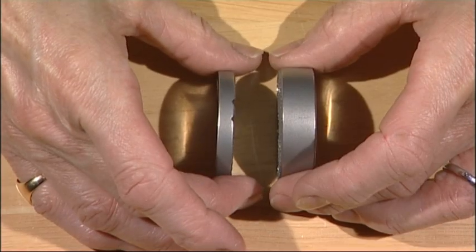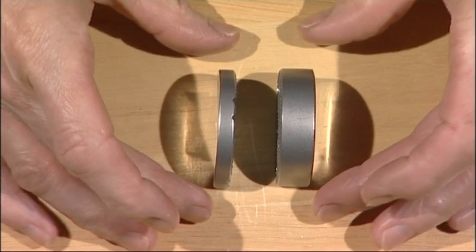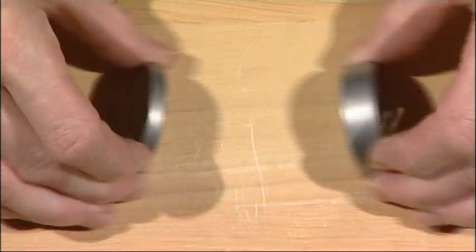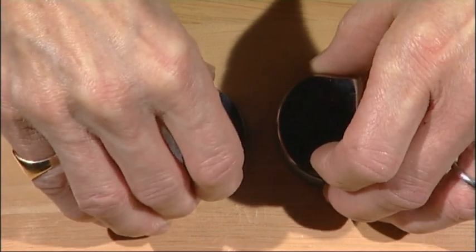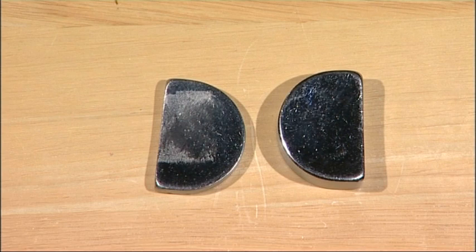And more time was spent on perfecting the fixation of the joint than in devising any suitable alternative. It was in 1950 that McKeever used an interpositional metal plate on the tibial plateau, principally for rheumatoid arthritis. This was more successful than Mackintosh's earlier acrylic version used for correcting varus or valgus malalignment.